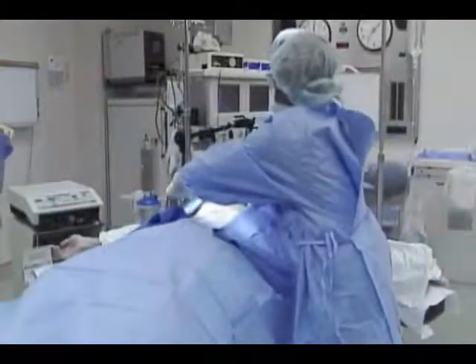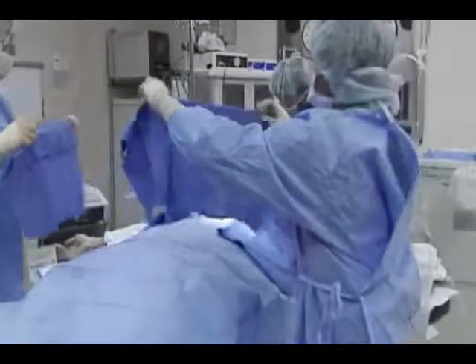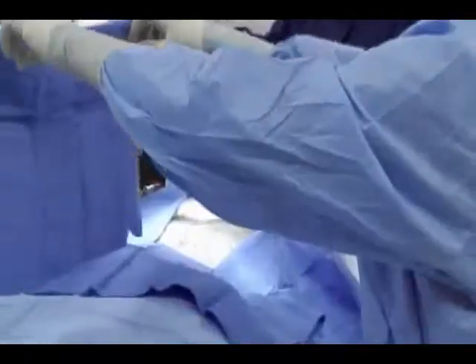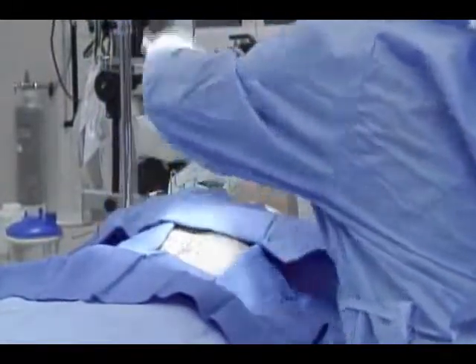The surgeon places sterile towels around the incision site and covers the patient with sterile drapes to complete the sterile field. This will aid in protecting the patient from infection.